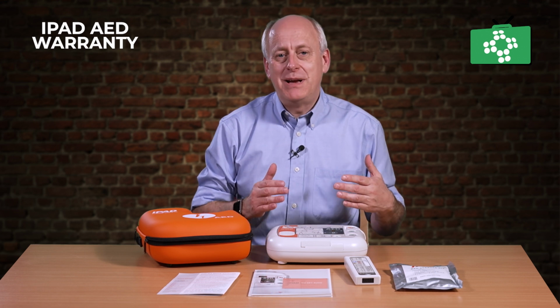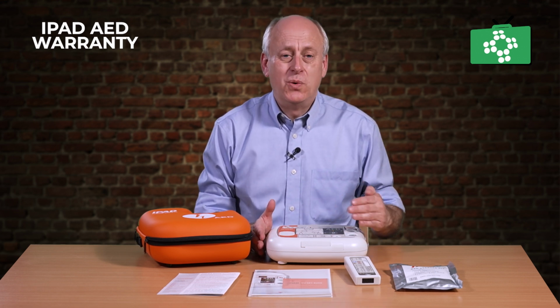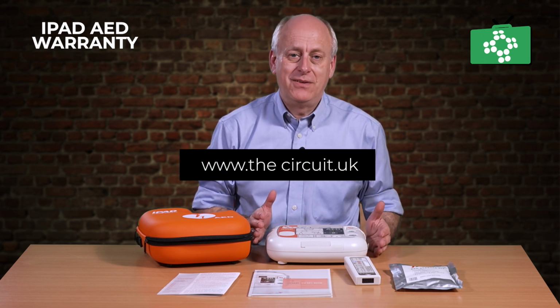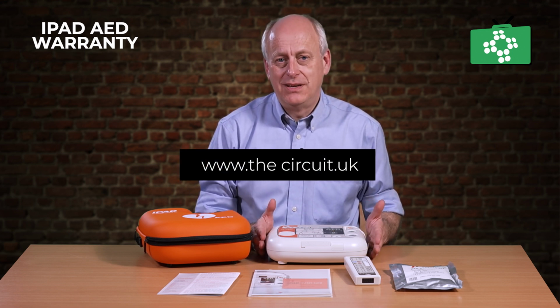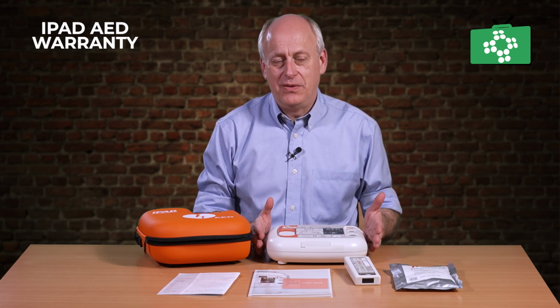Now, this is not directly about the warranty, but it's also a good idea when you're registering the unit to also go on the circuit and register your AED, so that it can be found on the standard 999 service. You can do that at the circuit.uk if you wish to register it on the network as well.